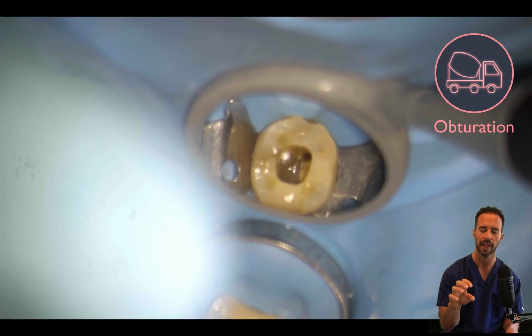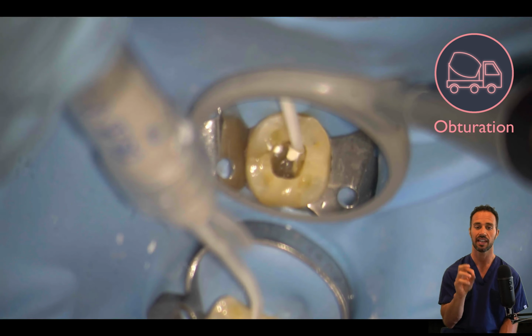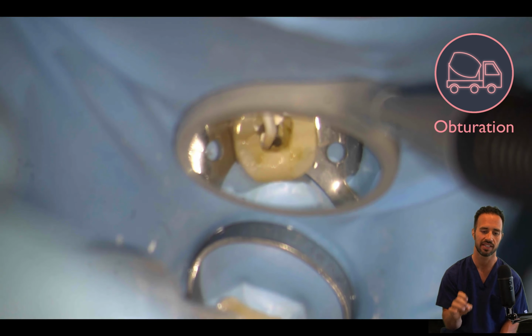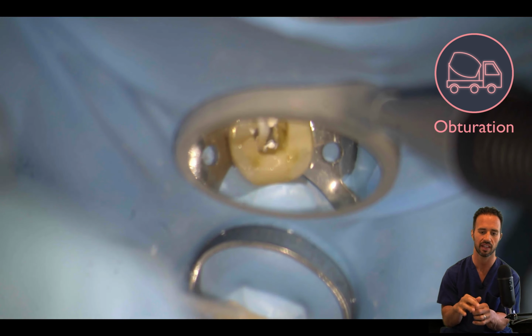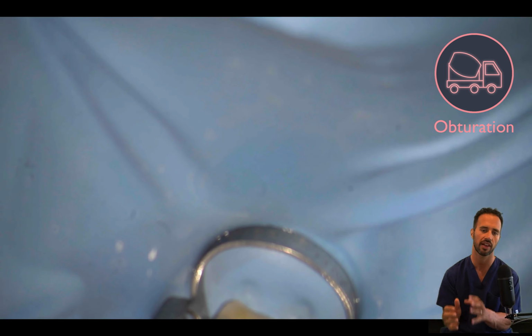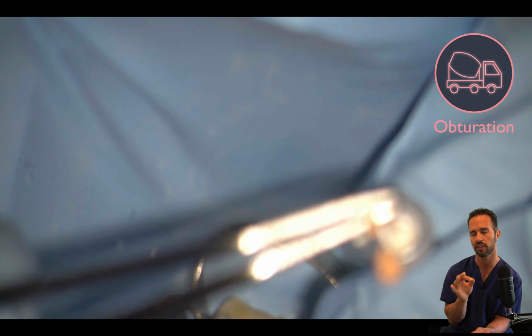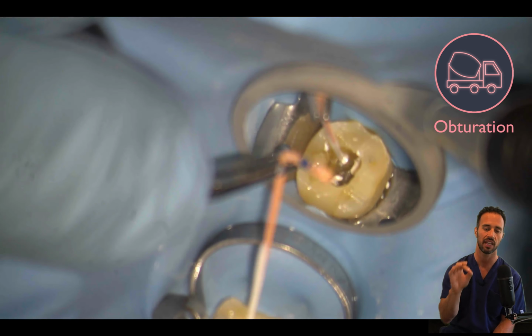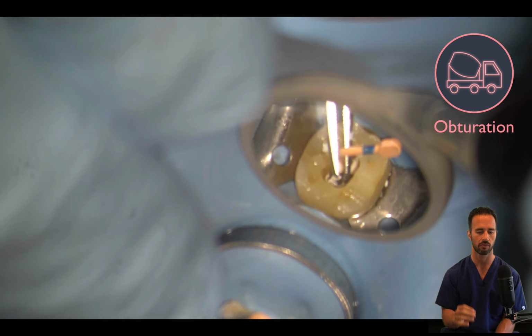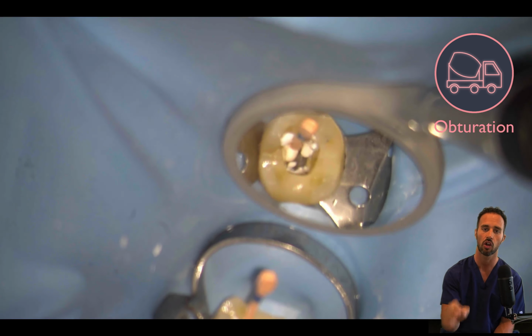And now we're applying our Brasseler BC sealer in all 4 canals. Again, really passive seating of that syringe tip in the canals, and you can see the distal merging canals are filling each other as I'm loading them up. Removing the tip from the sealer and dunking the cone that's pre-measured 20.5 millimeters before I seat it in the ML canal first, because remember, MB canals usually merge with ML canals. We want to seat the longer first always.